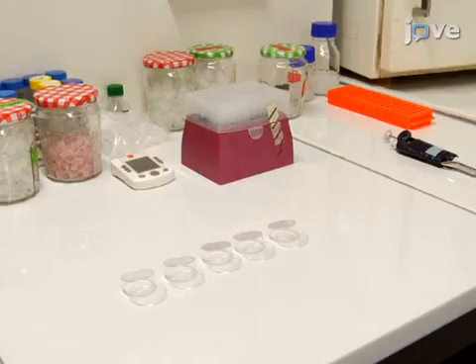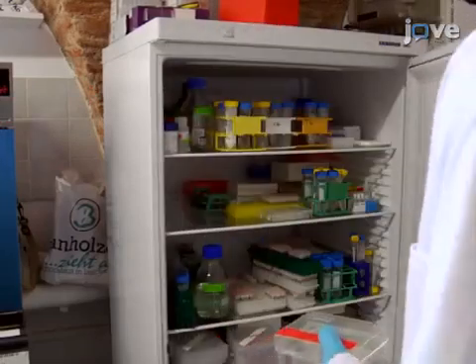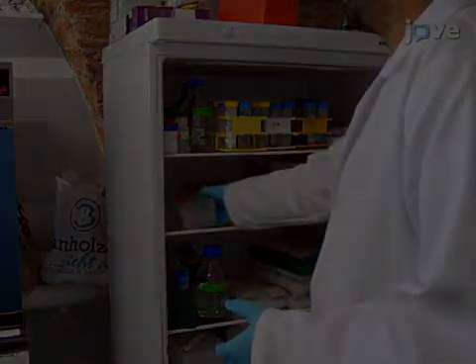Discard the solution and let the petri dishes dry upside down at room temperature for 2 hours. When dry, store the coated dishes wrapped in a plastic wrap at 4 degrees Celsius.